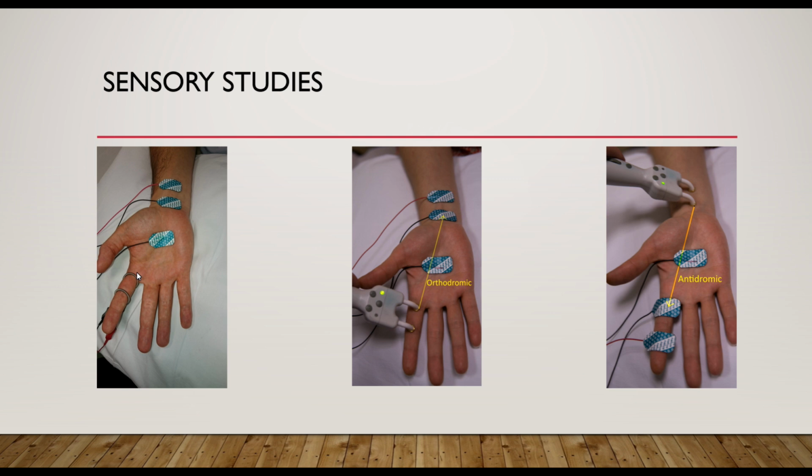Of course, when we're doing a nerve conduction test, we're not interested in stimulating these skin receptors to then send the signal along the nerve. We're depolarizing the nerve directly. There are ways of looking at the skin receptors, but in terms of what we're doing, with the charges that we're giving, we are directly stimulating the nerve underneath and depolarizing it, and then those signals are picked up by these two pads. The reason we have two pads is called differential amplification. It's to remove biological noise from the signal and to have a good signal to noise ratio. So that's why we have two pads.